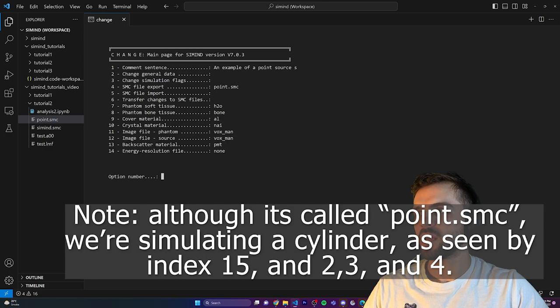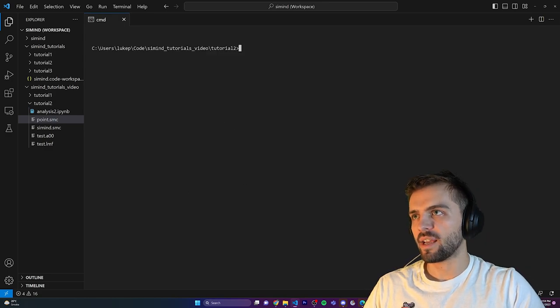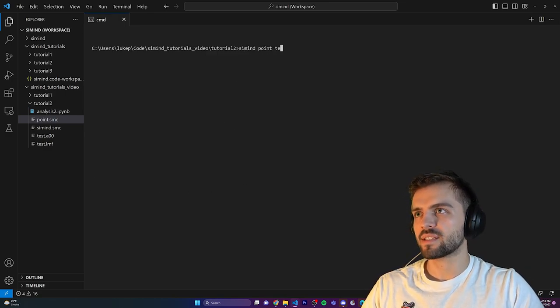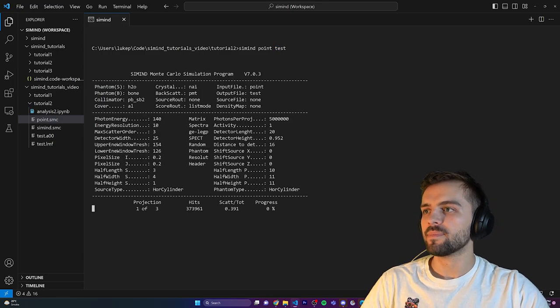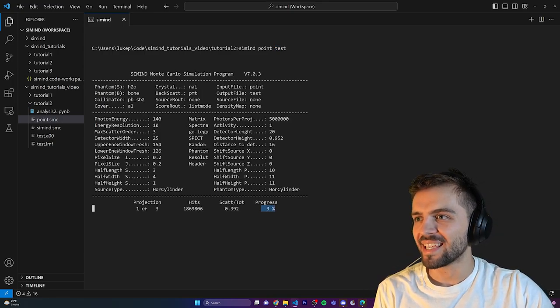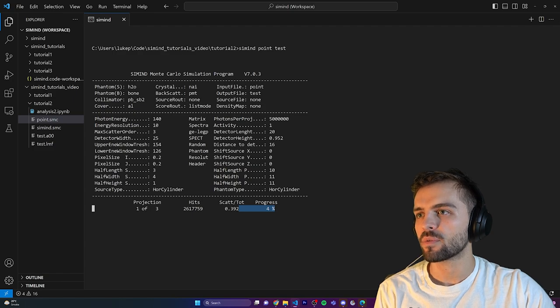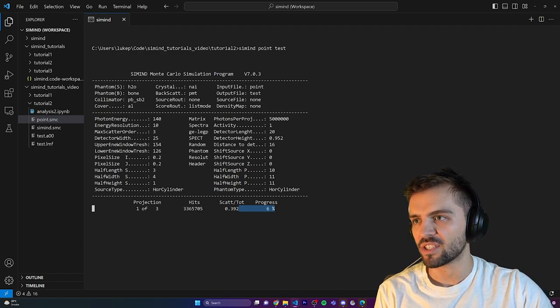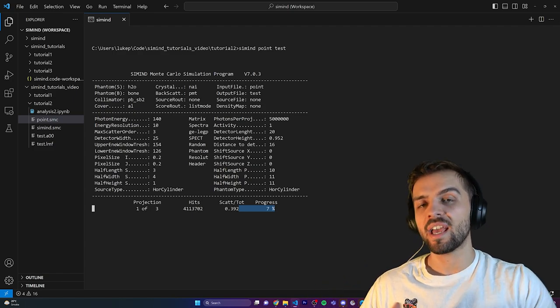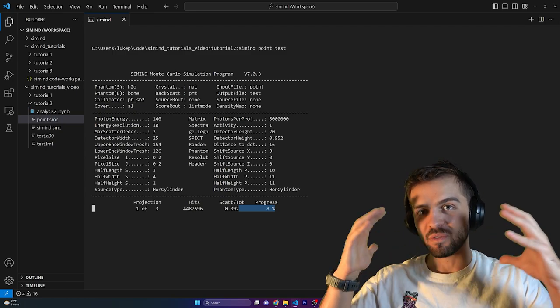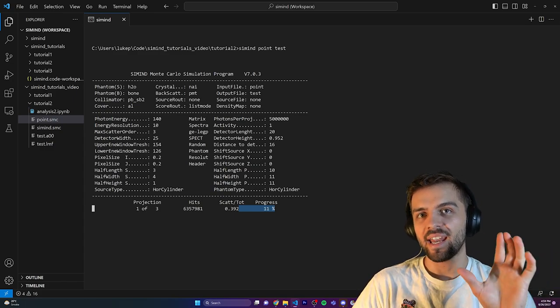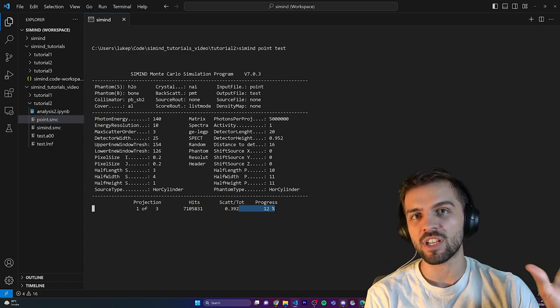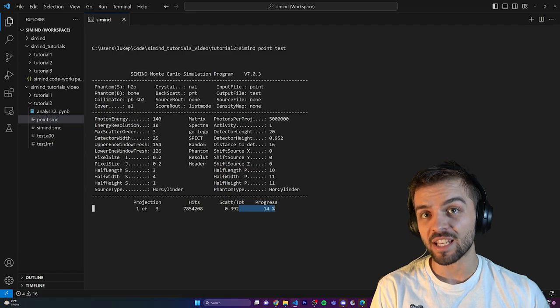Now I'm going to run the simulation: simind point test. It's going to run the point.smc file, with all files saved as 'test'. You'll notice it takes a little bit longer than the scatter window routine. The main reason is it's saving data to disk, and list mode files contain a large number of data — we're simulating five million different photons, and it has to save a number of parameters for each individual photon.